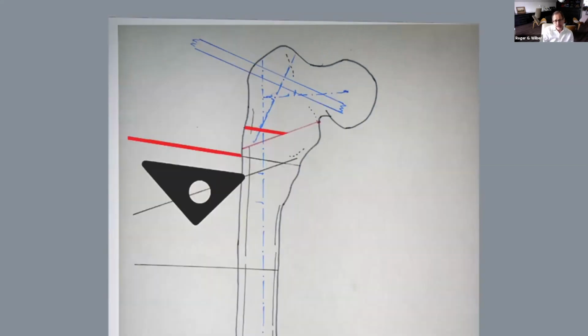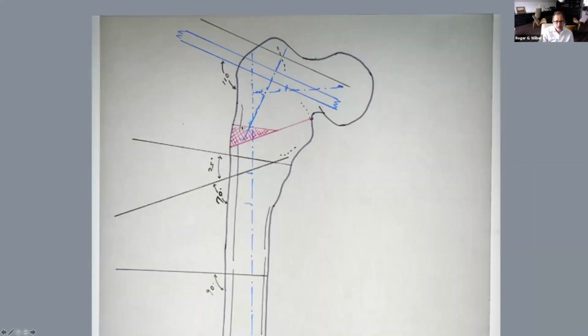Then the next pin that you're going to need is something to guide the shortcut, right? You have this smaller, shorter cut that you have to make. And that pin is going to go in based at 25 degrees, right? You need 25 degrees off of this wedge. So we'll take the 50-degree angle, we'll bisect that one. That's going to give us 25 degrees. And I can use this edge right here to guide the placement of this pin, which is going to guide my hand with my saw for that cut.